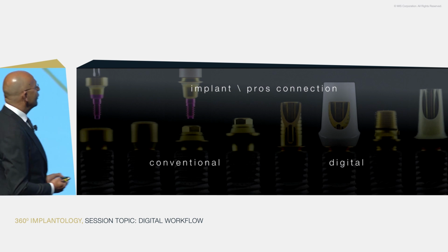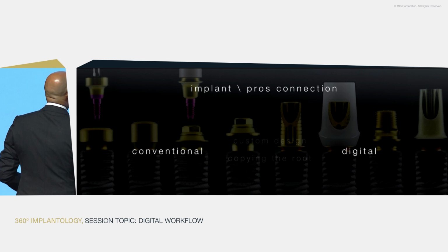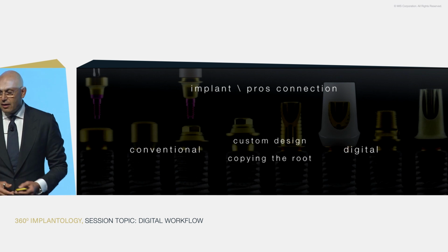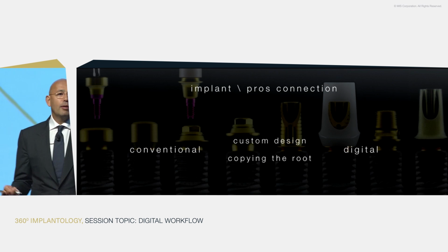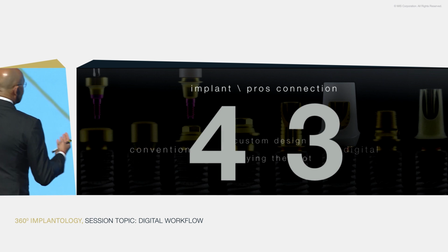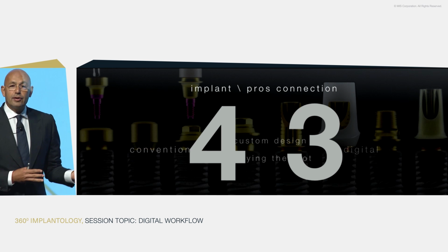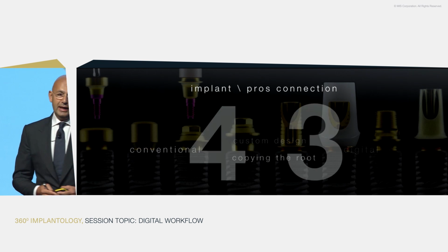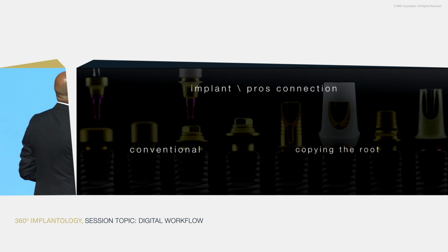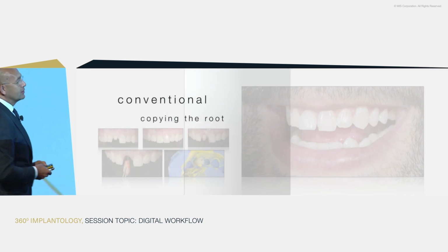We can either go conventional or digital. And in both ways, we can either custom design our abutments or we can copy something that will be looking more natural. Today, I'll talk about these 4 instances in 3 different patients. First patient is with the conventional way by copying the root.